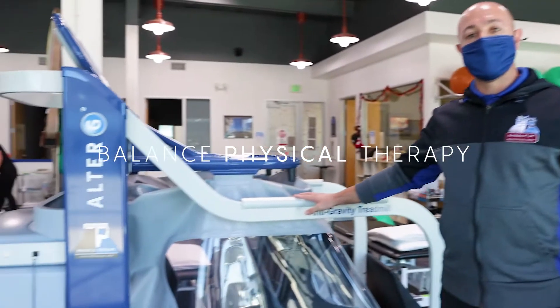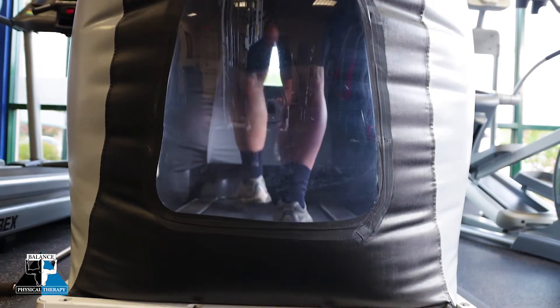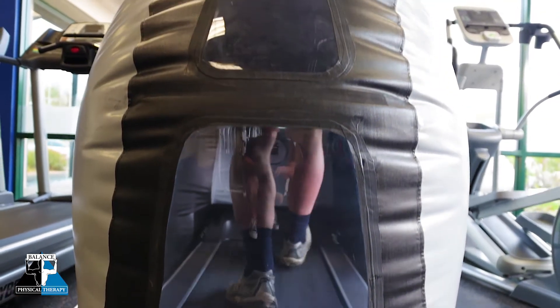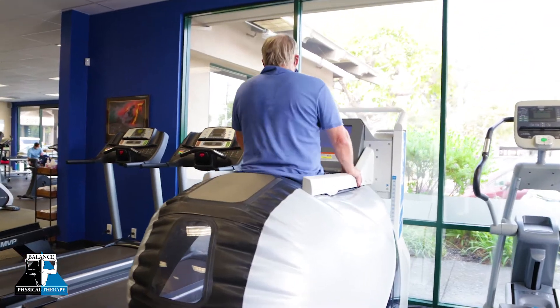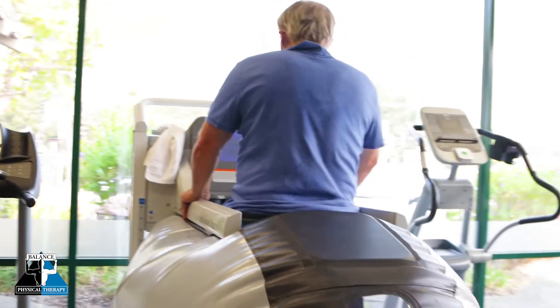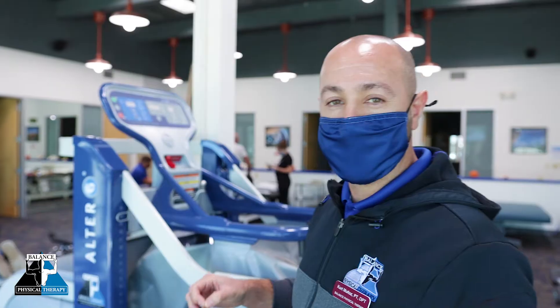This is our Alter-G Antigravity Treadmill, and what this thing does is essentially we can use it for many different reasons. We can use it after surgery, so if a patient is non-weight-bearing or only a percentage of weight-bearing on one or two limbs, we can use this machine to calibrate to their exact weight and dimension, adhering to their physician's limitations or precautions.